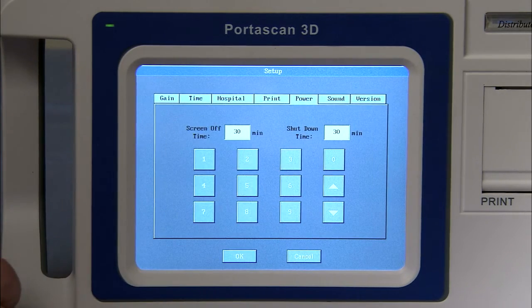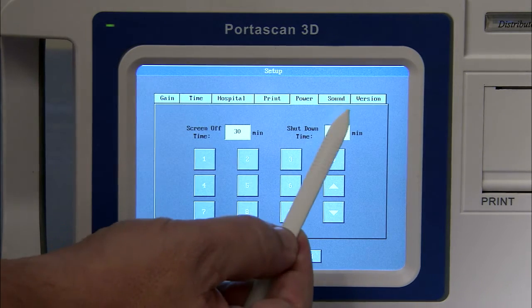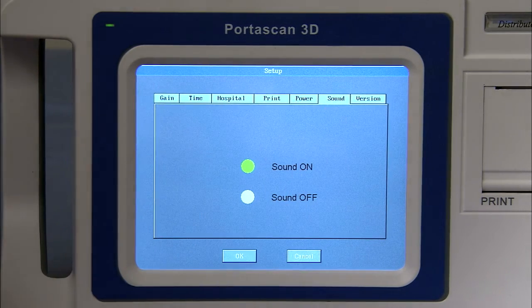Next is the power button, which determines when the system will power off. One of the nice features is that due to the short boot time, you can set it to power down after five to six minutes of inactivity, which will save battery life. The battery life is around five to six hours based on standard use. The last button is the sound button, which enables you to turn off the beeping sound of the probe when activated. I suggest leaving it on, so you can maintain the correct probe position during scanning.